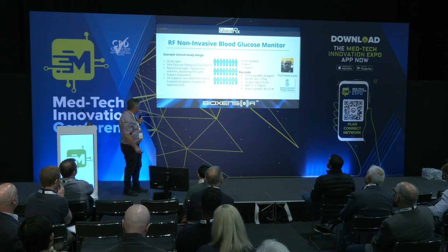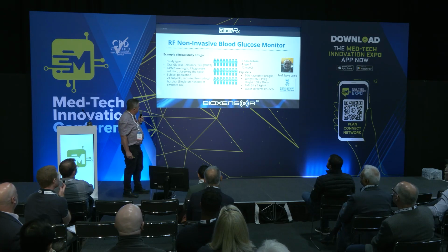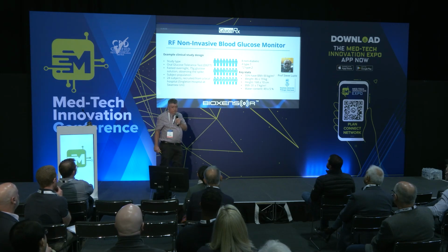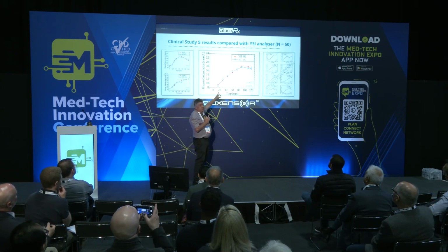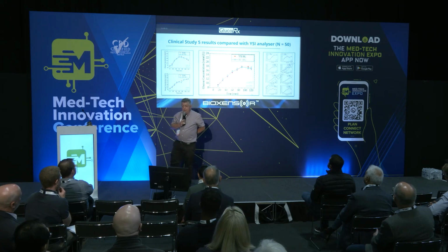I'm not really qualified to talk about a lot of the information on this slide, but it's a typical sort of study. This was a 24-subject study. The most recent one we did was 50 subjects, which I'll show you the results for in a minute. So some of these are non-diabetic, some have type 1, and most of them have type 2 diabetes. And this is what we measure. So we measure the blue trace here, which is the RF measurement of blood glucose. The red one is what we get from the Yellow Springs instrument.